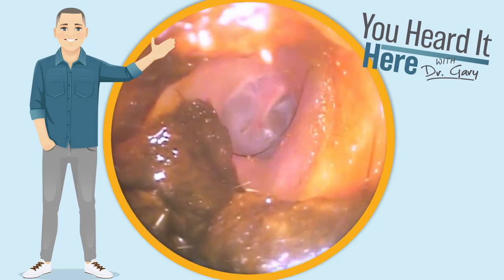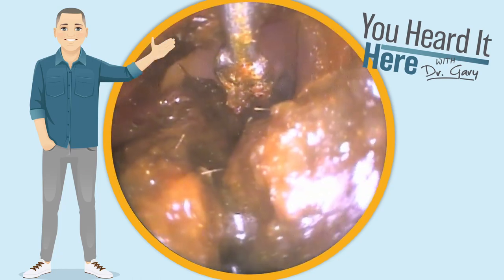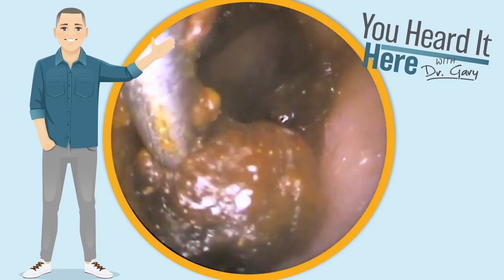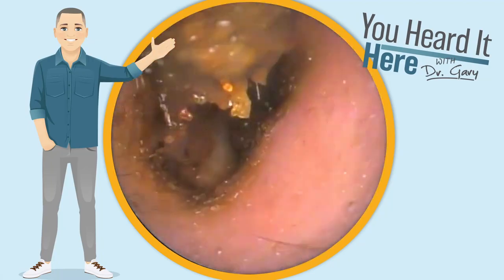On the other side, much less of an impaction. This time, all of the wax has settled to the bottom and sides of the ear canal wall. We should be able to get everything out pretty easily, hopefully not needing any more irrigation.